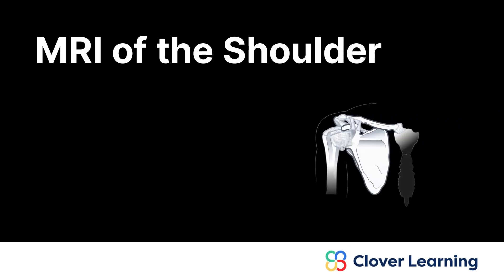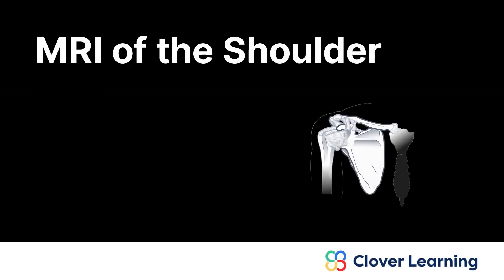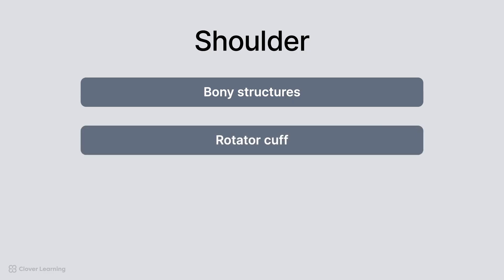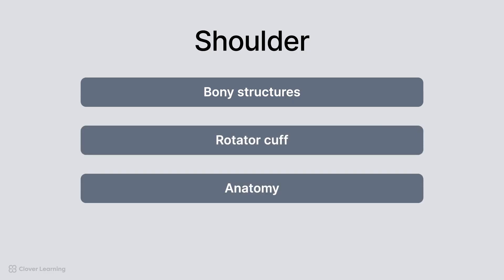Hey everyone! Welcome to today's lesson on the MRI of the shoulder joint. In this lesson, we will look at the bony structures of the joint, the parts of the rotator cuff, and anatomy on different planes of MRI imaging.